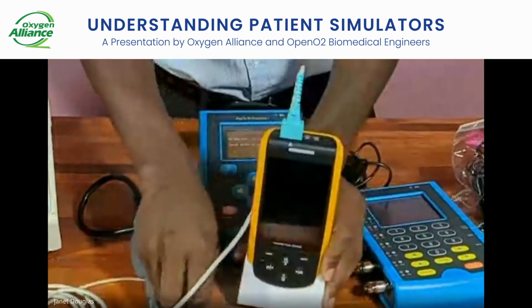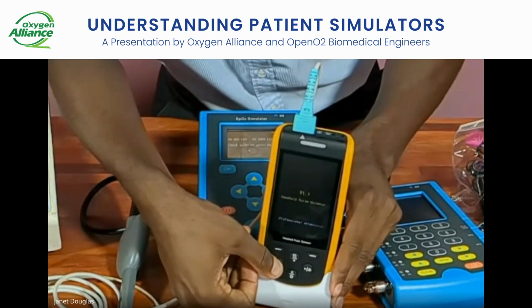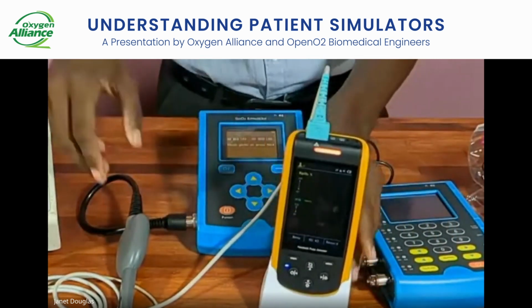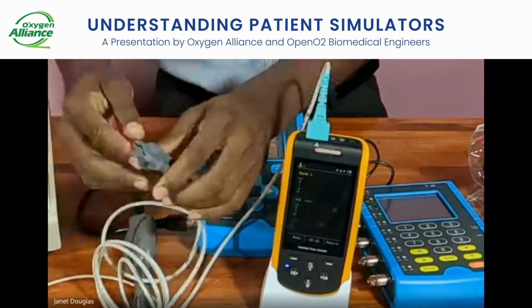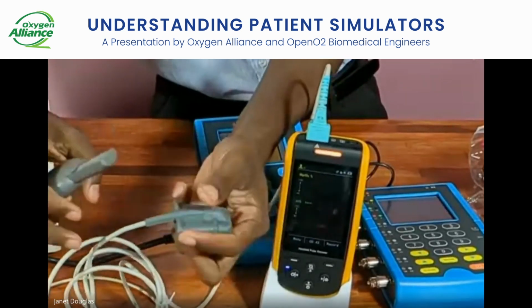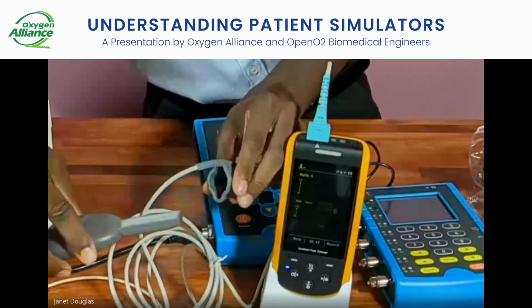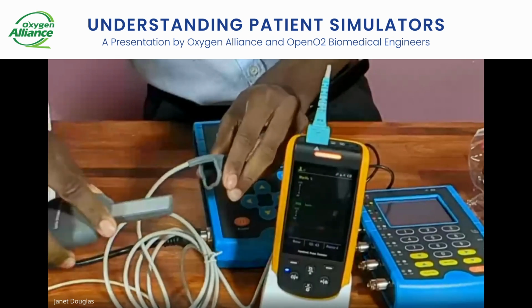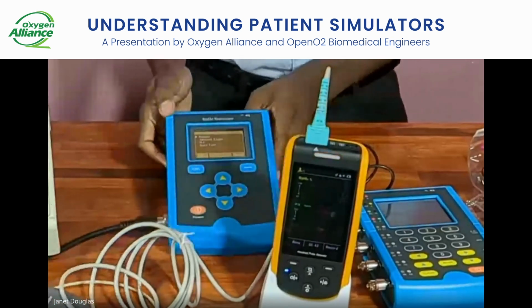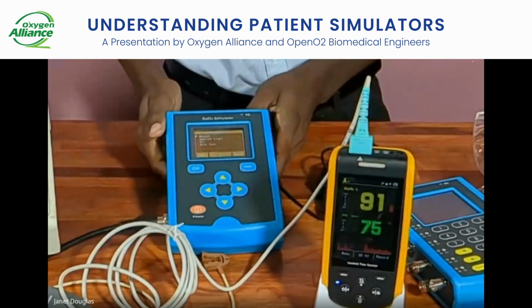So this is the pulse oximeter that we have. I'll switch it on. And this is the probe for the pulse oximeter. I'll put the probe into the pulse oximeter. Make sure the probe is placed in the right way, and make sure this part is facing where the light is coming from inside the probe. I'll place it like that. And we have connected everything. So right now we're going to do the manual test.